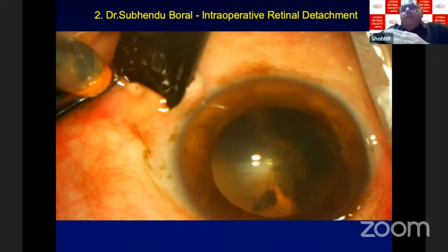Yeah, I would just put in my opinion, and I would like the opinion from Manish, Pramod, and you and the rest of the panel. If we notice such a thing in the beginning of the surgery, like before ERM removal, and where we are also planning an ILM peel with it, I would be inclined to put 1.5 to 2 ml of PFCL in the posterior pole to stabilize the whole place and avoid any peripheral central traction while I'm peeling, wandering into the periphery, and avoid that bulla from forming.